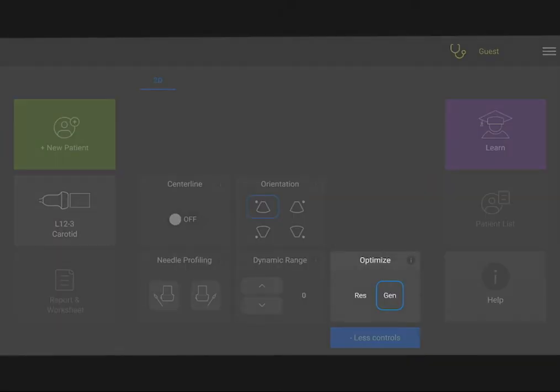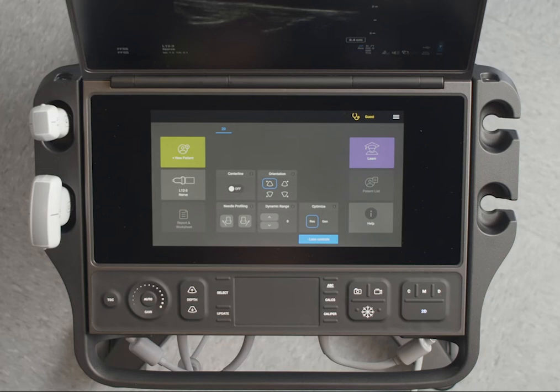The Optimization Control automatically optimizes your image if you need to scan shallow or deep structures. Tap Res for the best possible resolution.